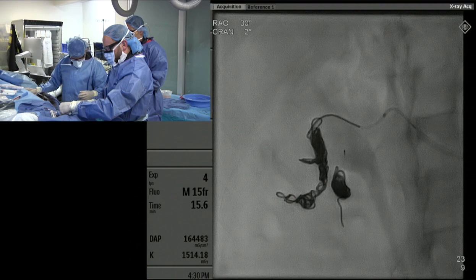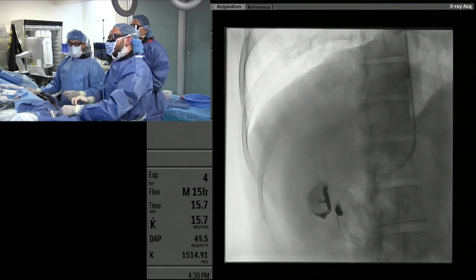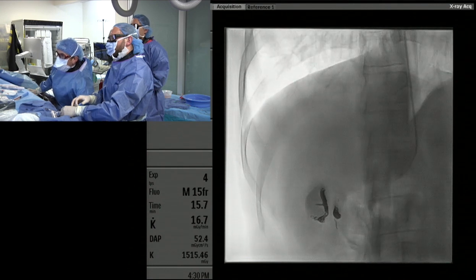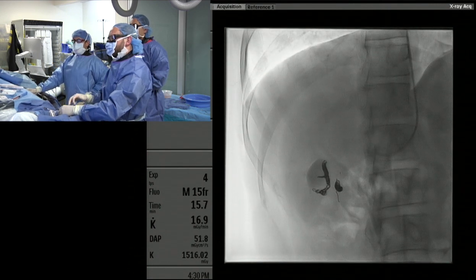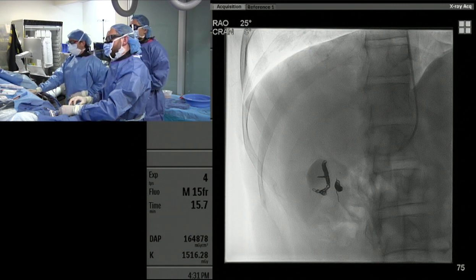Sir, can you hold your breath? You can breathe in a second. Breathe again, and then hold your breath for us, okay? Okay, do it one more time. Okay, keep holding it.